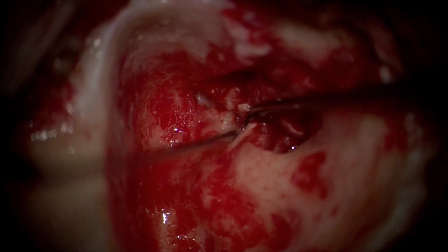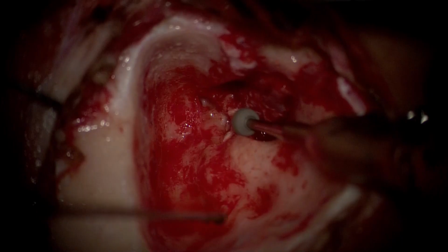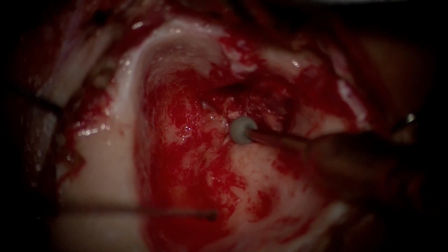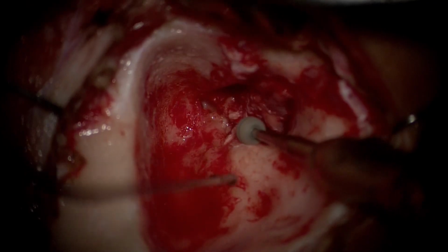because the facial ridge still has to be thinned from the anterior portion, that is the mesotympanic portion, as we are unable to see in the posterior mesotympanic recesses. So at this point of time, the visualization of the posterior mesotympanum must never be compromised. One mustn't do surgery without seeing.